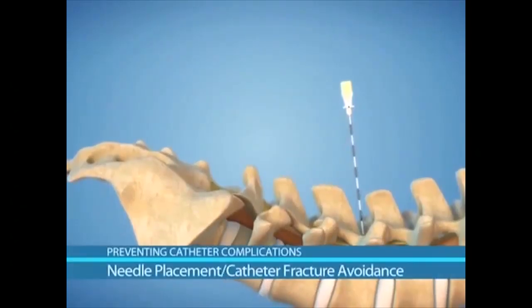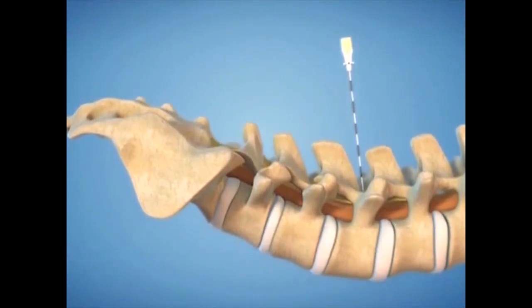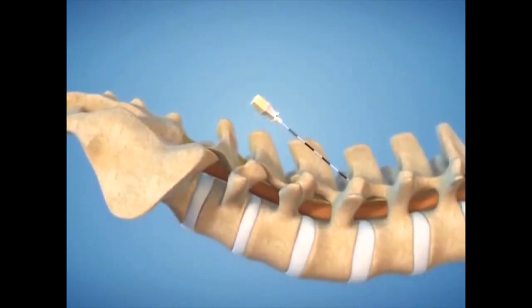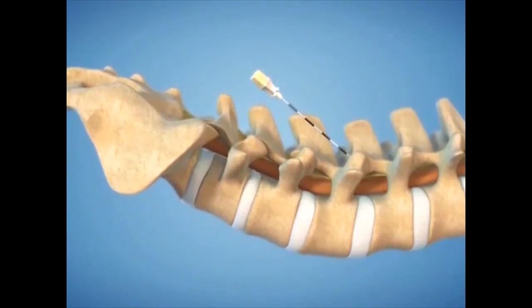The needle insertion method for passing a catheter into the intrathecal space has included both midline and paramedian oblique approaches. In comparing the two methods, the paramedian oblique needle insertion technique is recommended because it causes fewer long-term catheter fractures and breaks. The midline needle placement technique is similar to a standard lumbar puncture.